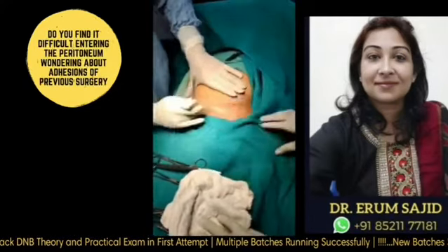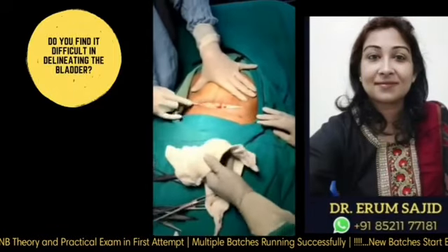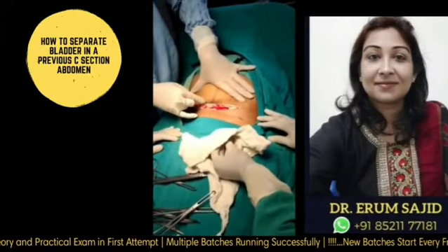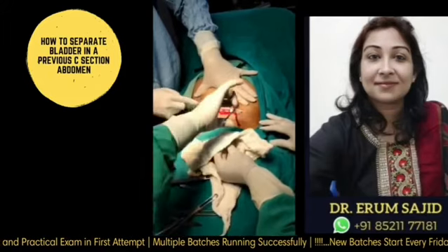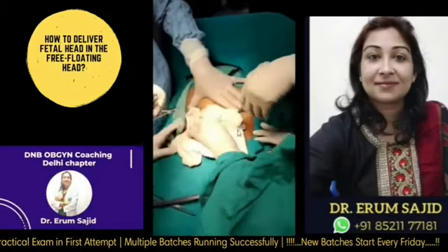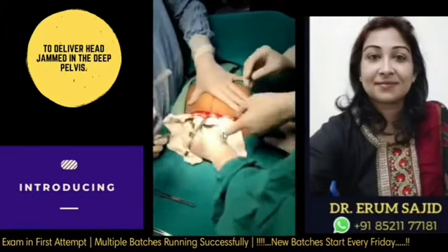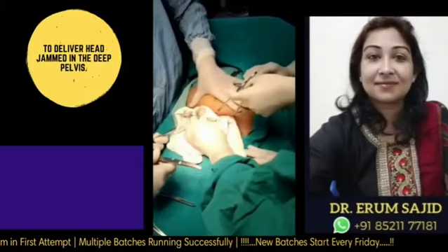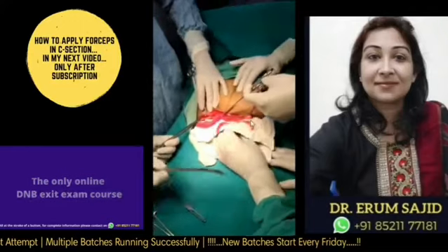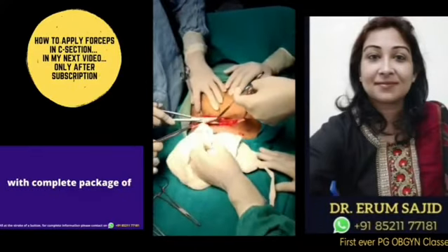After checking the spinal anesthesia and taking permission from the anesthetist, I start by giving a transverse incision. Here I'm delineating the previous scar, because it was a little hyperplastic, a little fibrosed, a little keloidic in nature. So I'm trying to remove the previous scar. My assistant is holding the previous scar with Allis forceps, and now I'll remove it with a curved scissor.